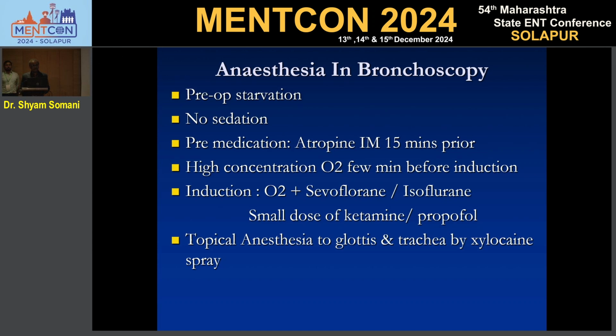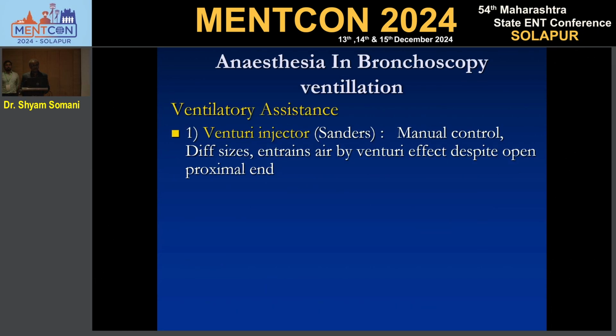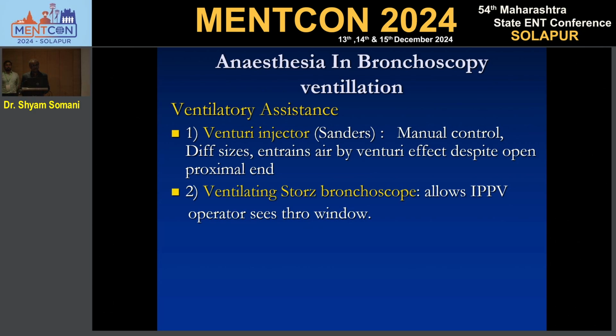A small dose of propofol is preferred, and scoline. If the time is increasing, then you can go with atracurium. Monitoring is with the routine monitor. My preference of anesthesia and ventilation is with Venturi, because it allows time and ventilation. Deoxygenation and hypoxia rate is very less, and you can monitor and do the procedure uninterrupted for quite a long time.